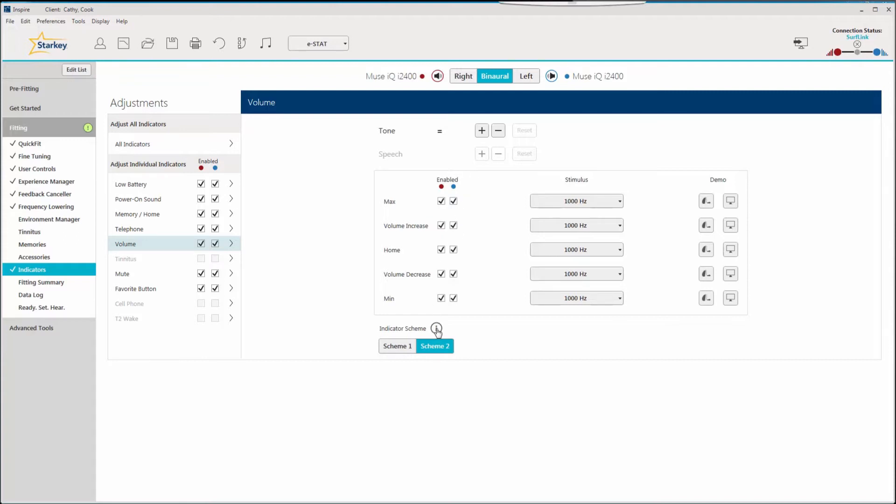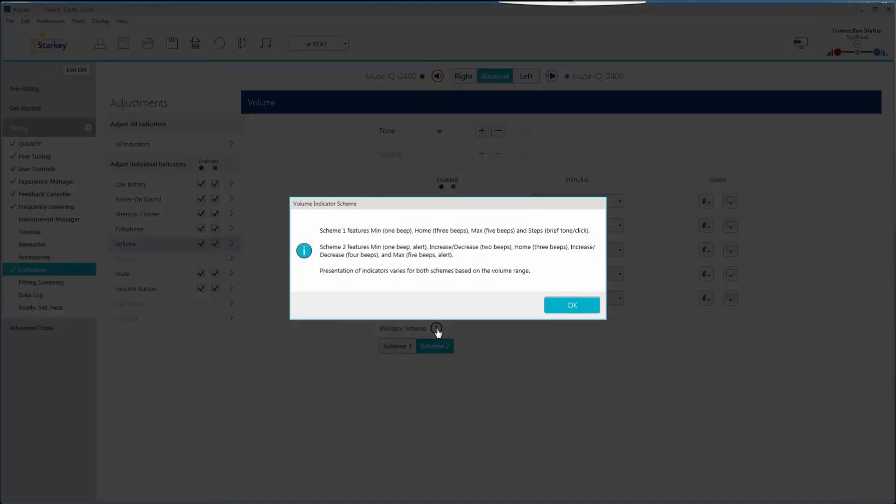Click on the information icon if you ever have a question about how these schemes operate and an explanation will appear.